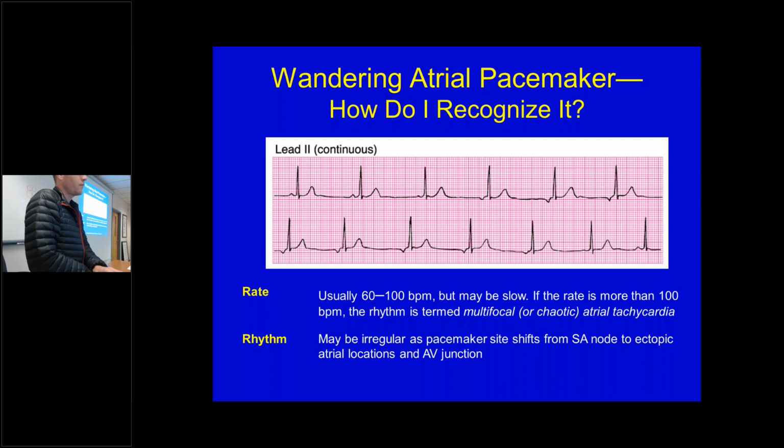All right, so this is one kind of P wave. That one is inverted as well, but it's a little bit different morphology, has a different kind of swoop to it. That one's a little bit flatter. That one's up and flat, and that's even more up. So you could say that's 1, that's 2, and then inverted. You could count all of those as 1 and say that's 3 different morphologies.